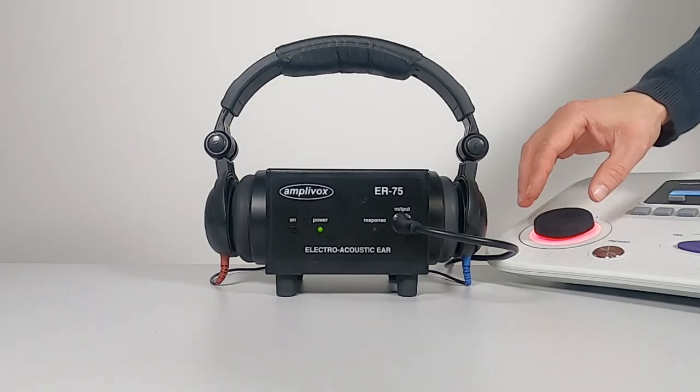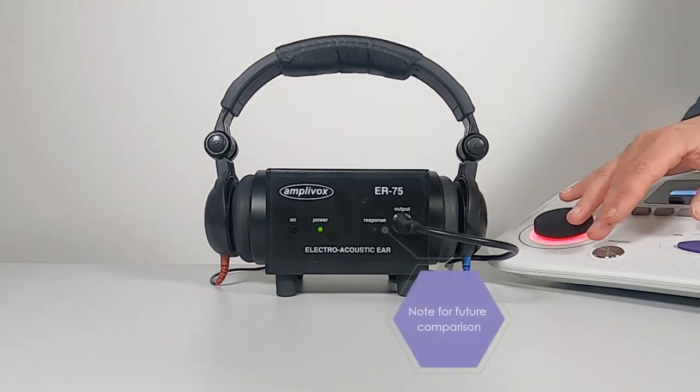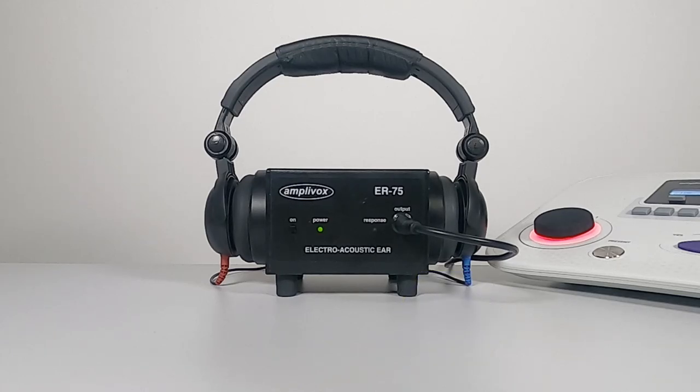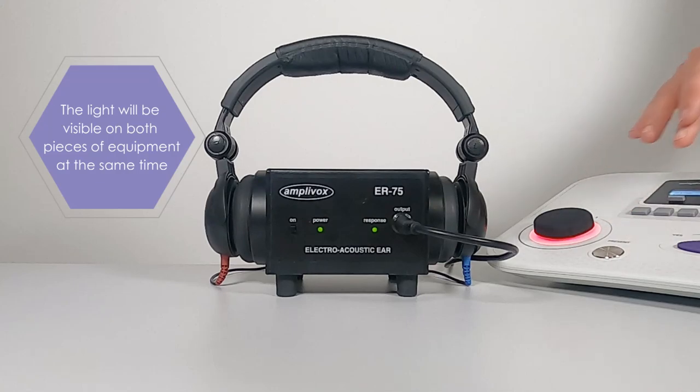Step 5: Increase the signal level in 5 dB steps until the ER75 responds, and note this threshold for future comparison. Where the ER75 is connected to the patient response socket of the audiometer, you'll notice that the response light will be visible on both pieces of equipment at the same time.